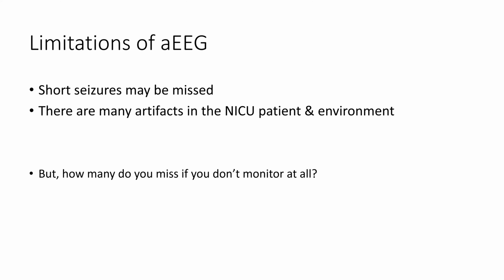But I want to just challenge you that if these are the limitations, are they acceptable to you? Because if you don't monitor at all, how many seizures will you miss? And the answer is you will miss all of them, or most of them, right? 80 to 90% of neonatal seizures are subclinical. So if we don't monitor, we won't see them.